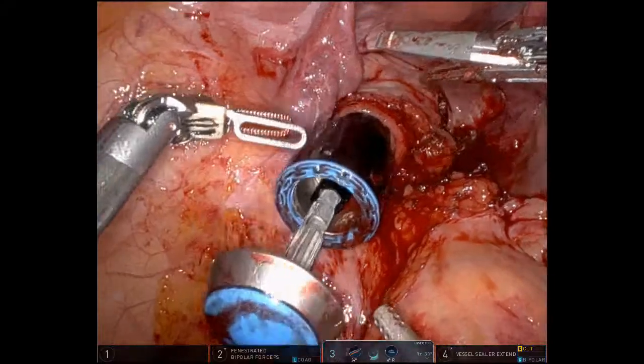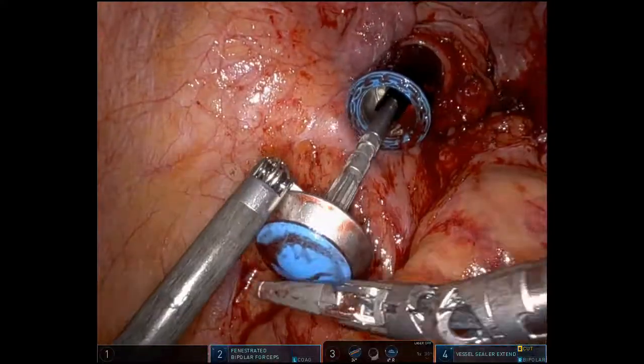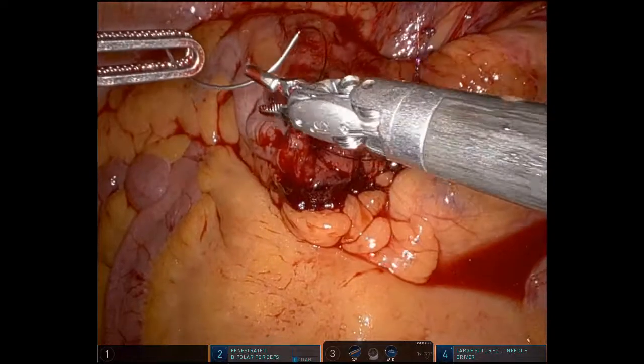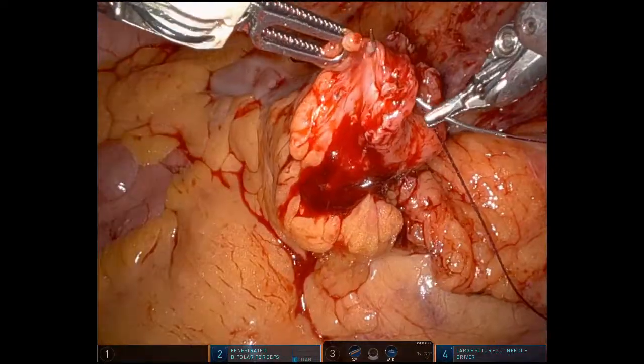We extracted the specimen, we removed the Alexis, and here we're introducing the anvil to the circular stapler. In preparation for the anastomosis on the cut edge of the left colon, we're putting in our purse string suture.